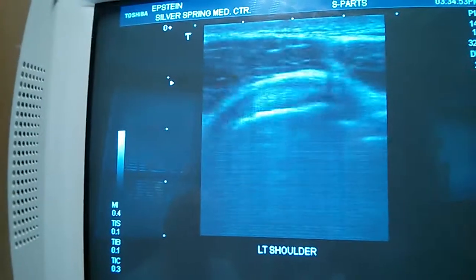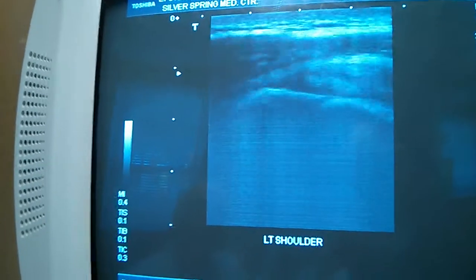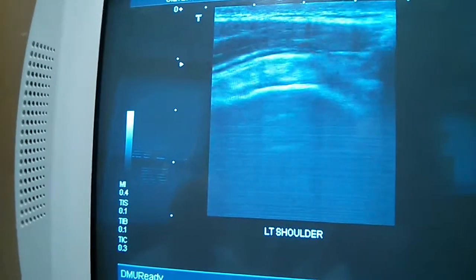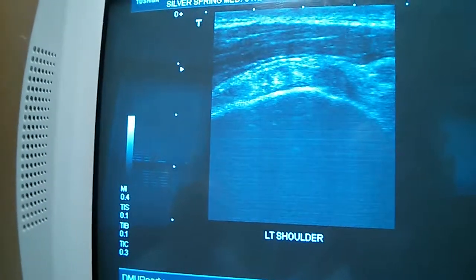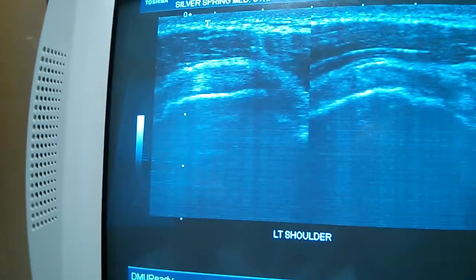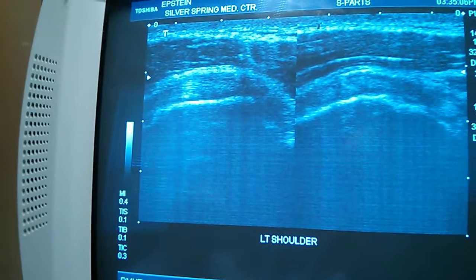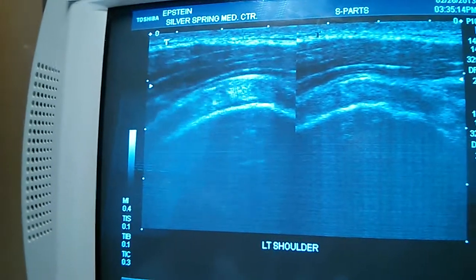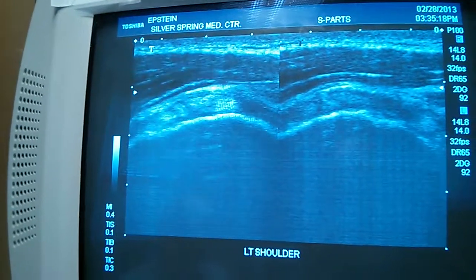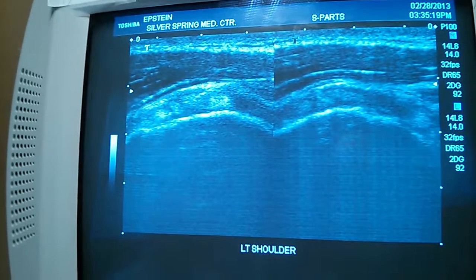So now I'm just going to turn this instrument, and now we're looking at that same muscle at a different angle. From the top, yeah. Wow, look at that. That's pretty cool. It does look pretty strong white there. Of course, I've never seen it before, so for all I know, this is what it's supposed to look like. Well, I think that suggests that it may be a little bit inflamed. Still a little inflamed after all this time.